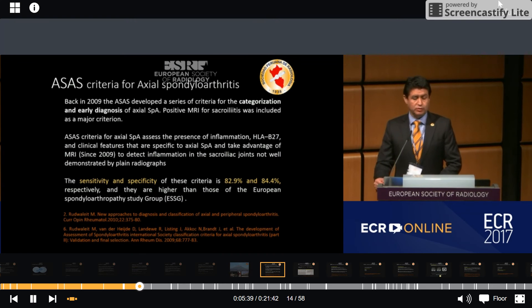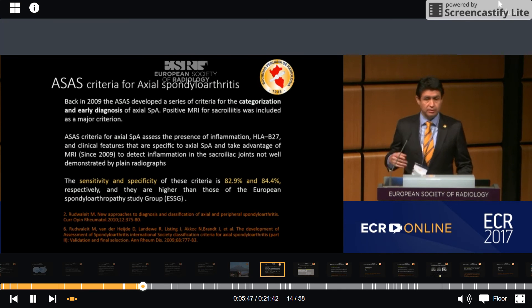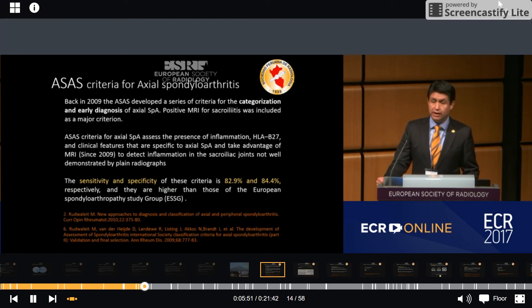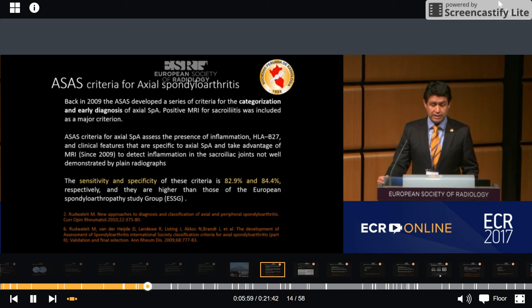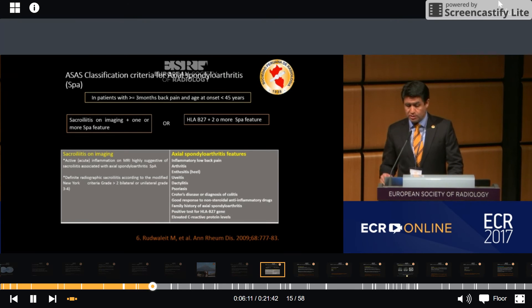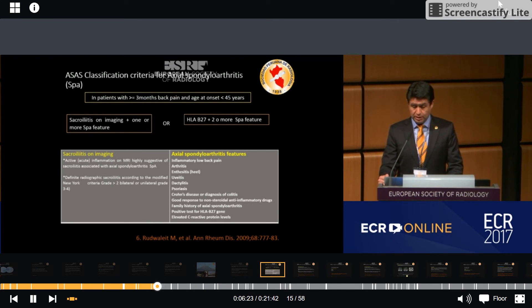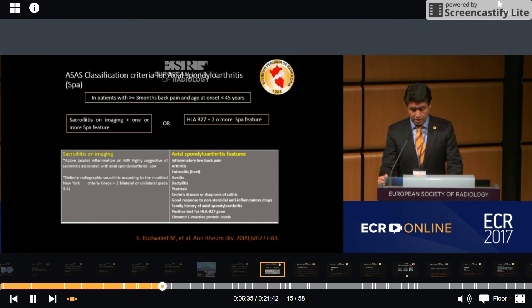ASAS criteria for axial spondyloarthritis assess the presence of inflammation, HLA-B27, and clinical features specific for axial spondyloarthritis, and incorporate MRI since 2009 to detect inflammation from the sacroiliac joints — not well demonstrated by plain radiographs. Using these criteria, patients are diagnosed with axial spondyloarthritis according to two classification pathways: one using imaging criteria with evidence of inflammation, either radiographic or MRI; the other using the presence of HLA-B27 and clinical features specific to SpA.